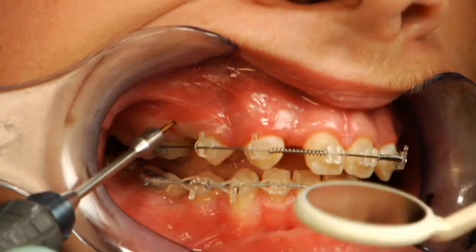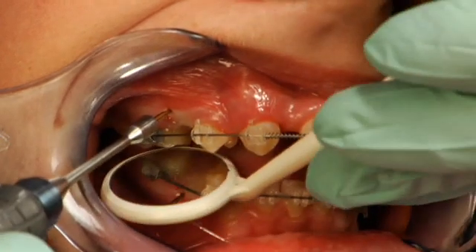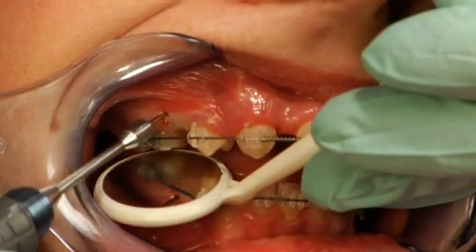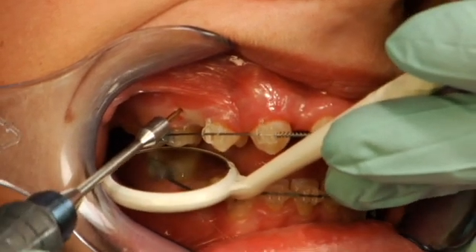Now we're going to check with an occlusal mirror — open slightly. We use the occlusal mirror to check angulation mesially or distally, to ensure that we have the correct direction of the mini screw as it passes mesial to the first molar.